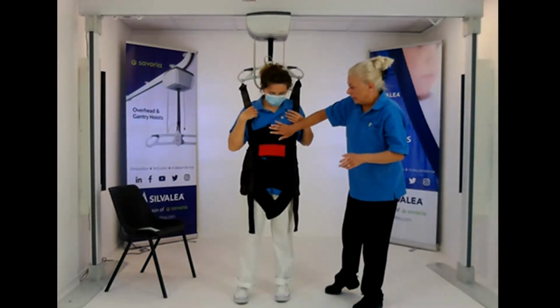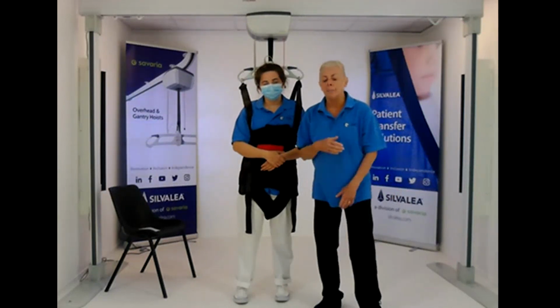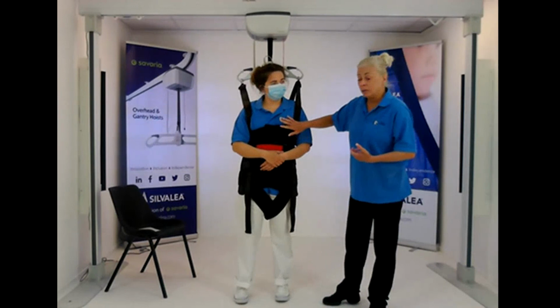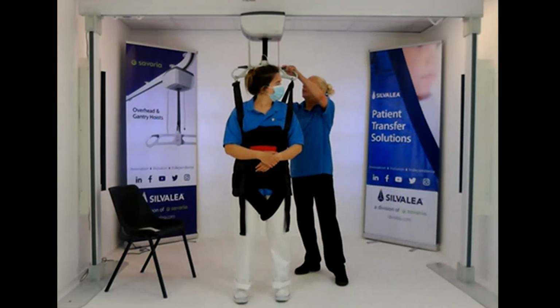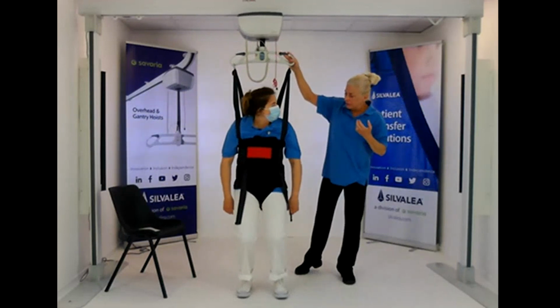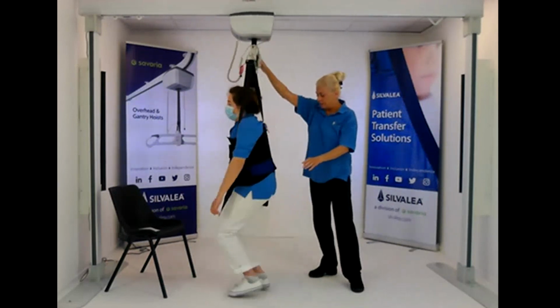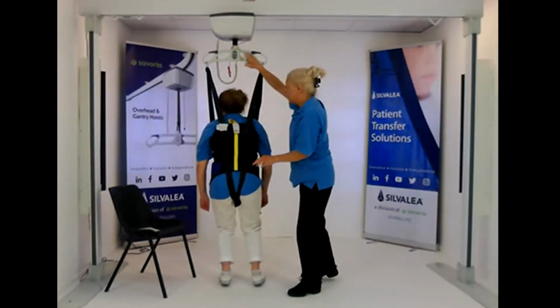But I know we've used it really well for someone that has absolutely zero tone, when they need to get them on their feet. It's all about well-being, getting them upright. And this will do this with practice. I'm struggling with my voice to go high enough, but if Laura was to lose tone, she's suspended in her parachute. So it looks like that. Do you want to swivel around just so that we can see? So it's giving a lot of support, but as I said, it is a difficult, complicated one.